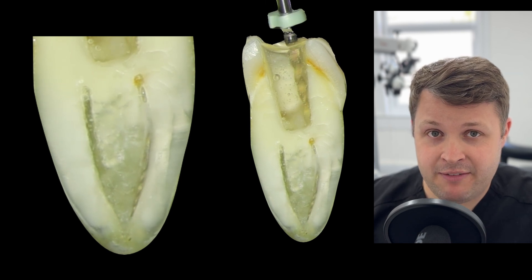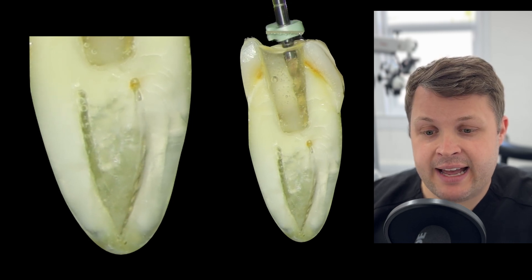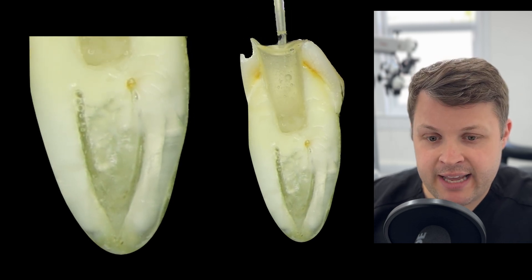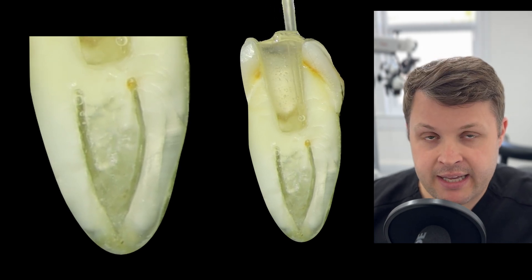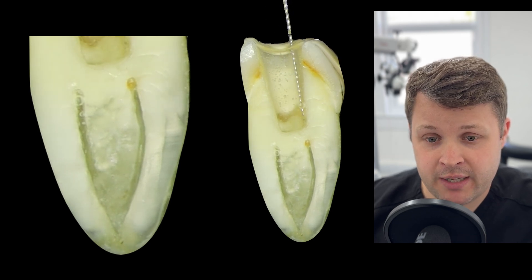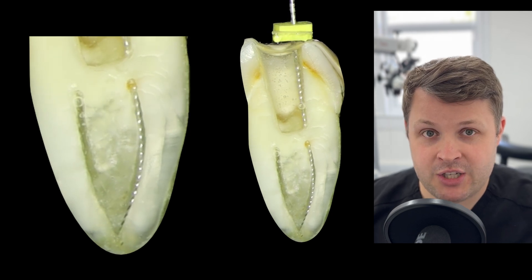I place the size 20 high flex straight onto the motor and try to negotiate it to length, but I can't quite get past that bend in the apical third. I pull the file out and irrigate. It's important to recapitulate when you're getting stuck, because you can create a ledge, and recapitulation can reopen the space you've cleaned. Debris can block that tiny hole where you had the glide path file.